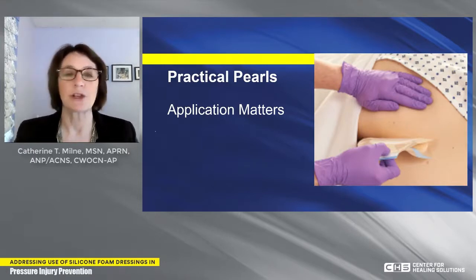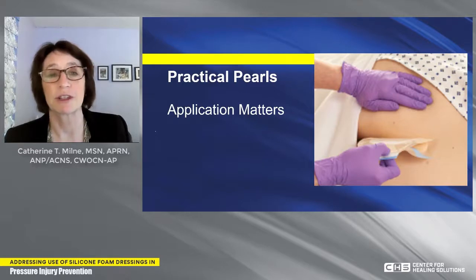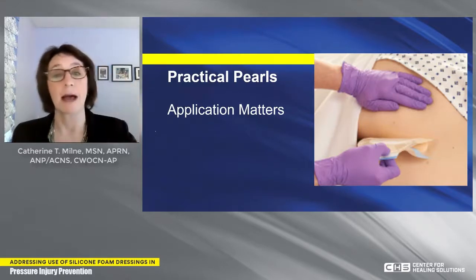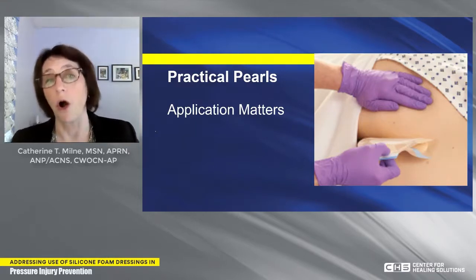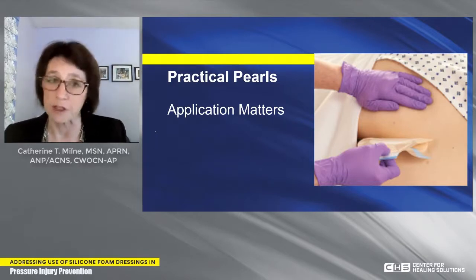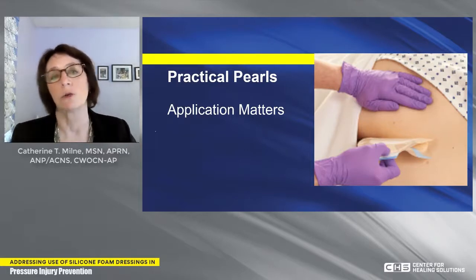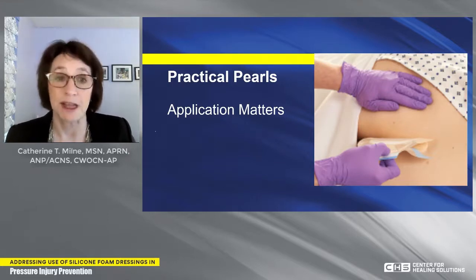If you see this picture here, we're folding the dressing like a taco, and it really makes sense. A lot of people don't apply these sacral dressings really well. They'll get a good seal on the right side, a good seal on the left side, a good seal on the top, but you know what? They don't get a good seal near the anus, and you actually cause this thing that I fondly refer to as a poop shoot. So any effluent that comes from the anus, any effluent that comes from the urinary system goes right into this little gap, and it sits on the skin, altering that microclimate and disrupting that skin barrier.